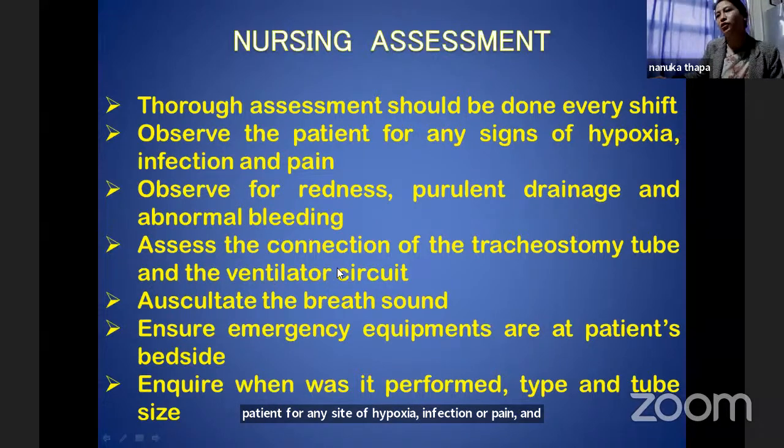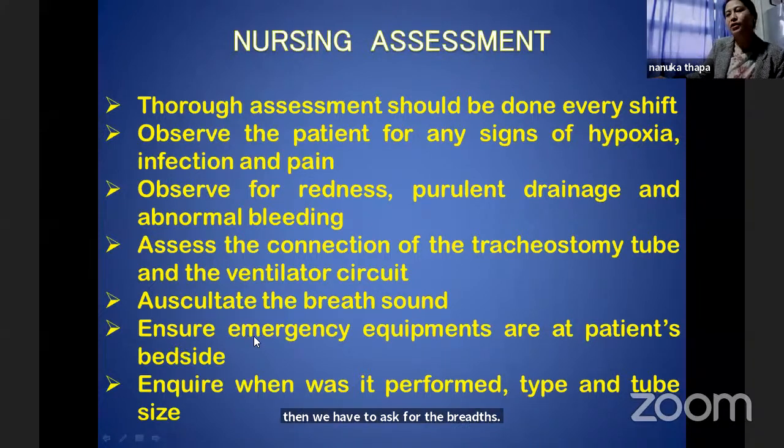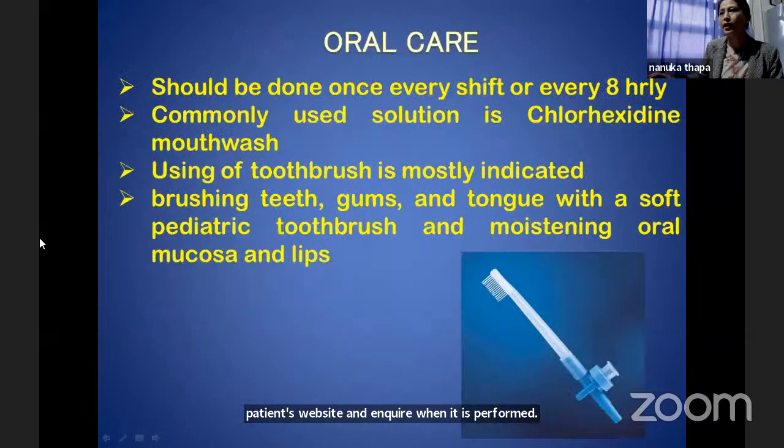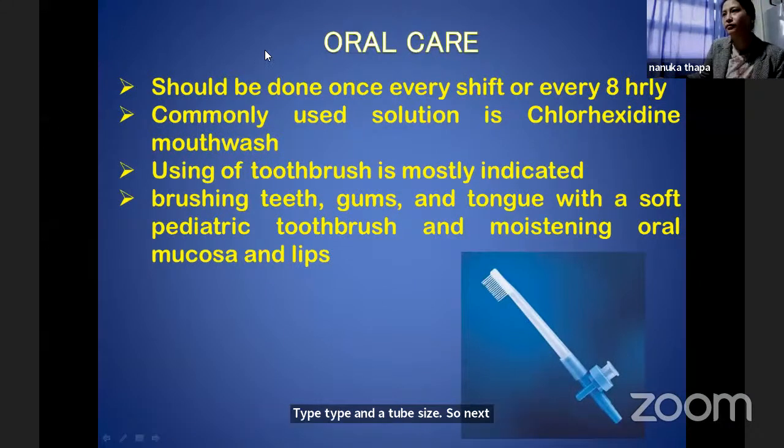Then assess the connection of the tracheostomy tube with the ventilator circuit. Then we have to auscultate for the breath sounds. And also we have to ensure emergency equipment is at the patient's bedside, and inquire when it was performed, the type and the tube size. So next is oral care.